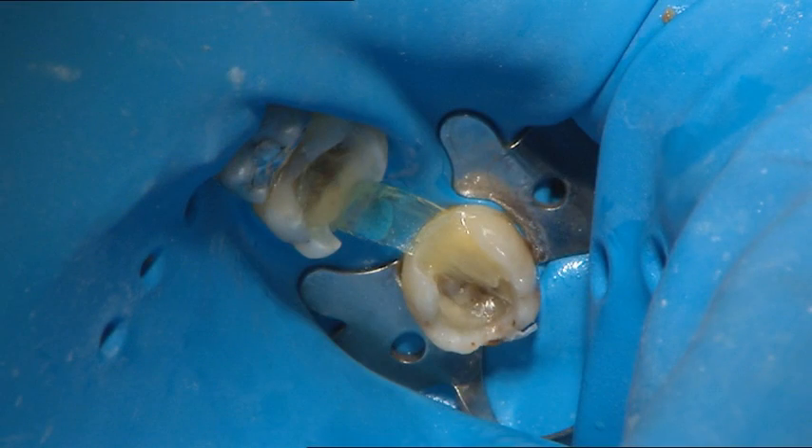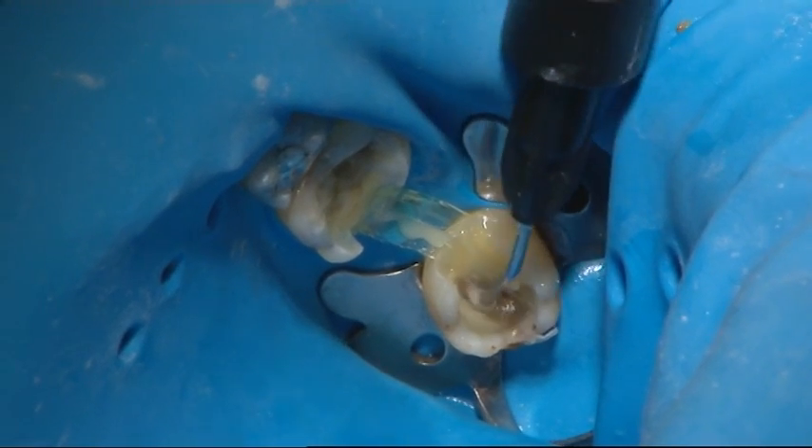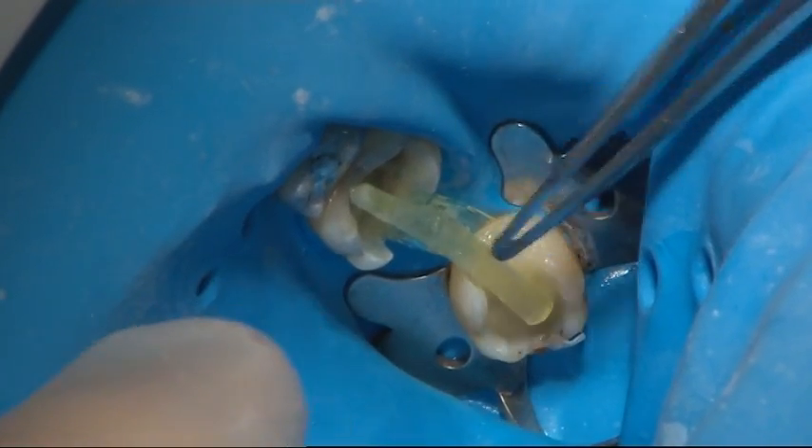For maximum reinforcement, the fibre was bent towards the gingiva; however, enough space was left for cleaning. The second fibre layer was then attached using flowable composite and light cured in place.